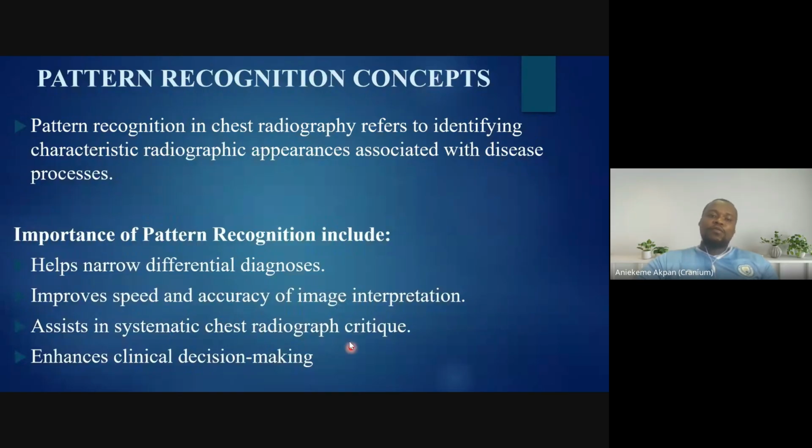No, you have to look at the chest systematically, because there are some things that you can pick that the doctor didn't actually consider, that might even contribute to the patient's symptoms. It can also enhance clinical decision.